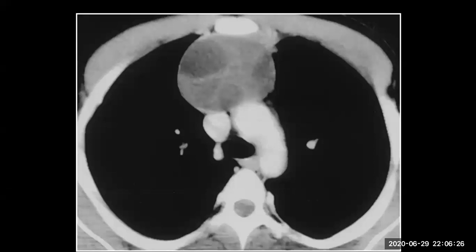Thymic origin, like thymoma, but here it is cystic. Any lesion in the thymus can be cystic, thymic cyst. Other differential? Lymphoma. Thymic cyst or cystic thymoma. حكيناها. اللي بعدها بعد اللمفوما، غالبا اللمفوما بتكون solid إلا إذا كانت نوع من أنواع الثيموما. Necrotic one. Okay. Other differential.